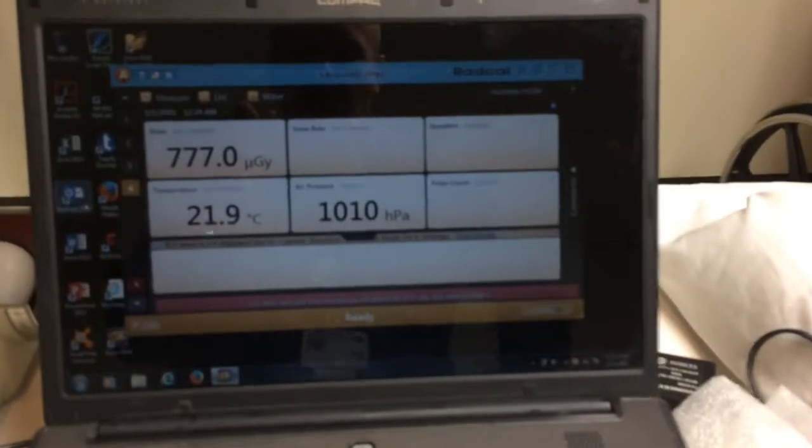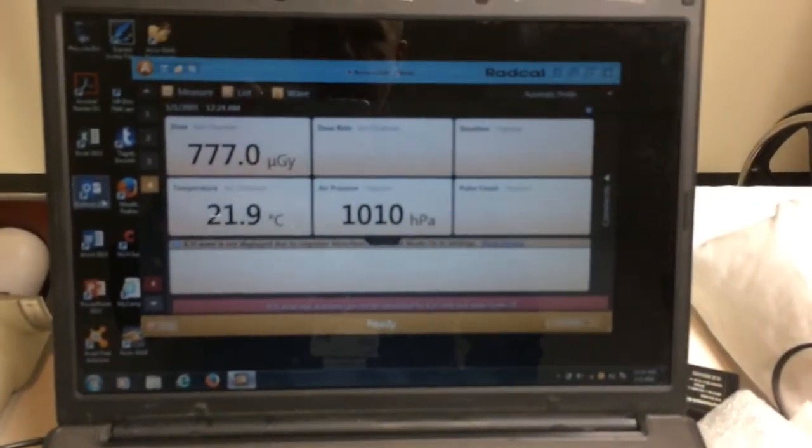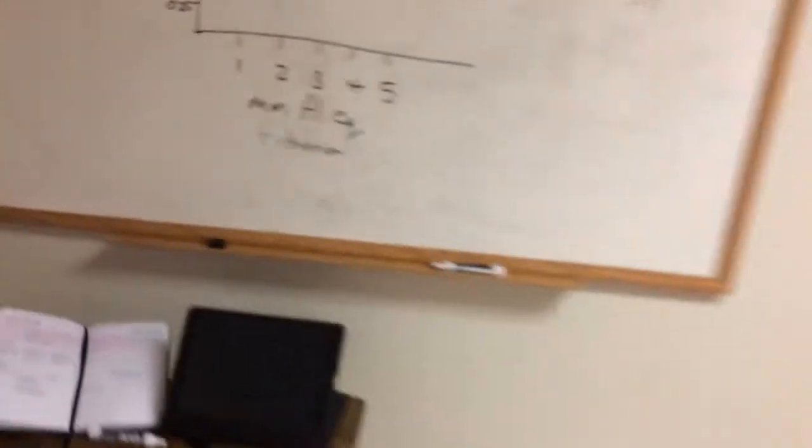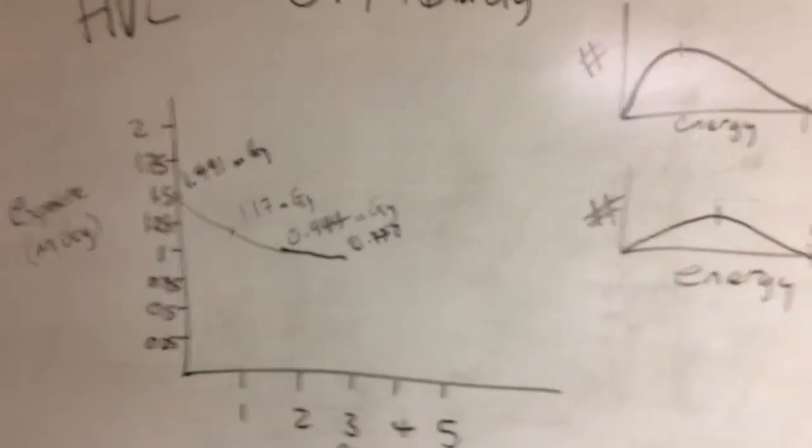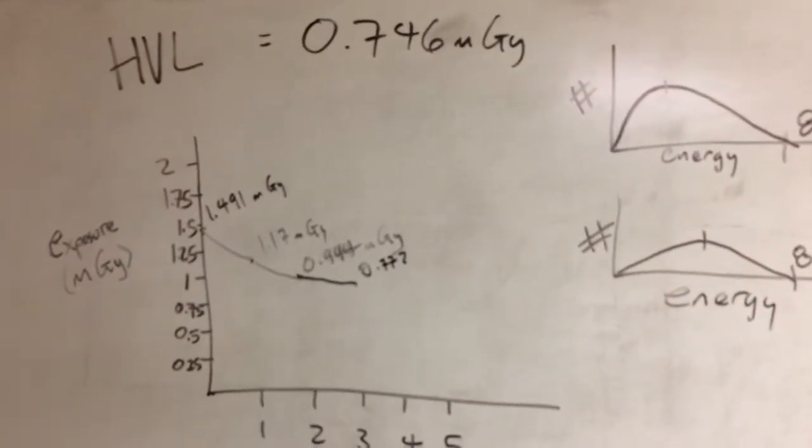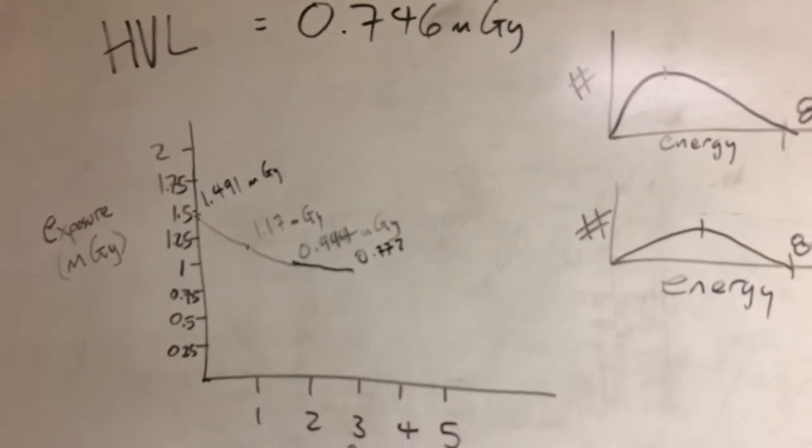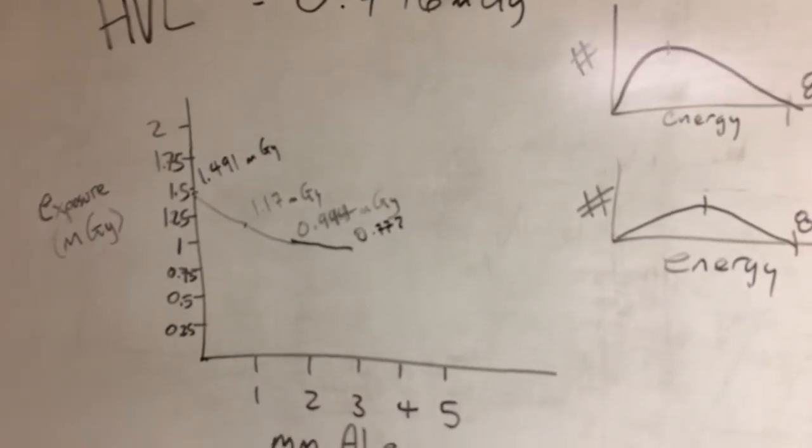I'm not changing anything about my setup except for the amount of filtration. Now we've got 0.777. What's interesting if we start to look at this line, we're getting very close. We're very close to our half-value layer. But it looks like the line is starting to flatten off.